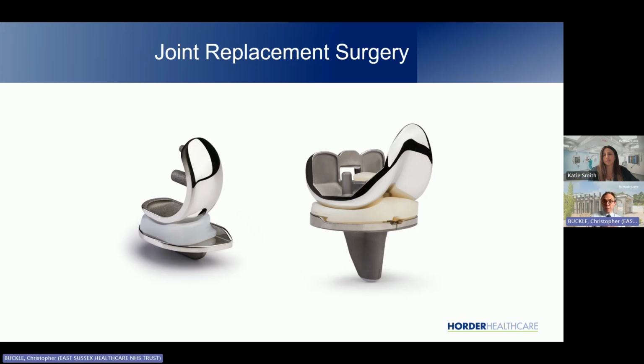But again, it's an informed consent process. It's important to understand patients' perceptions on risk, and some patients may not want the risk of redo or want to lower the risk of redo joint replacements. And so again, an individual discussion around the relevance of partial joint replacements and total joint replacements is what is suggested both on a national level but also on an individual and personal level. I do think it's a really important topic to discuss with patients.